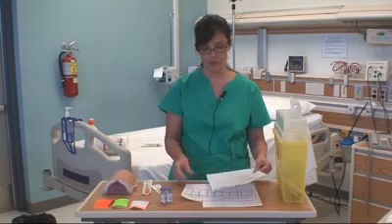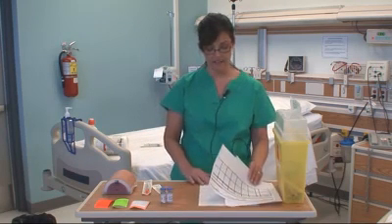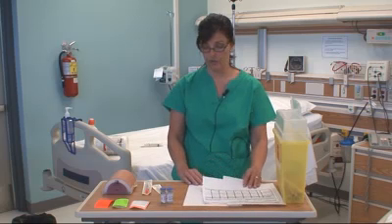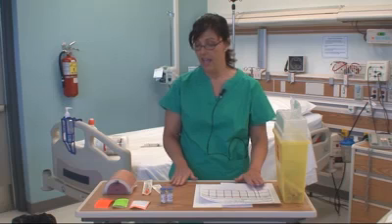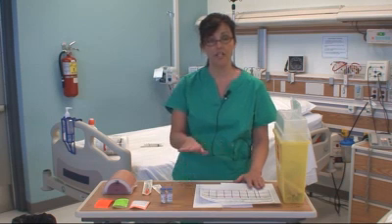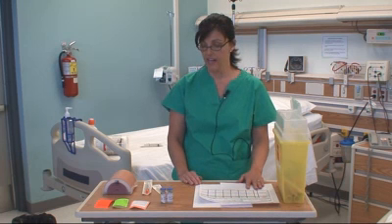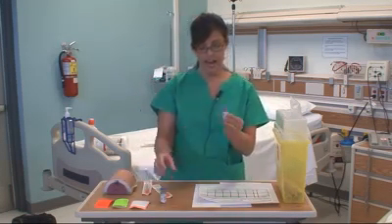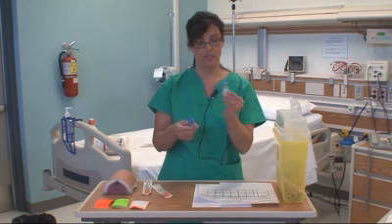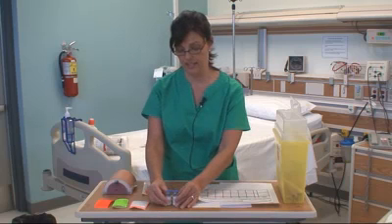So we have the doctor's order, and we have the medication record where we're going to sign off the medication afterward. Just to ensure, first we would make sure that our cleaning work area has been disinfected, which I did prior to this using the Virox wipes. Then I'm going to make sure I have my supplies. I have the Humulin N, which is the long-acting insulin, and the Humulin R. I have the 2 insulins as well.